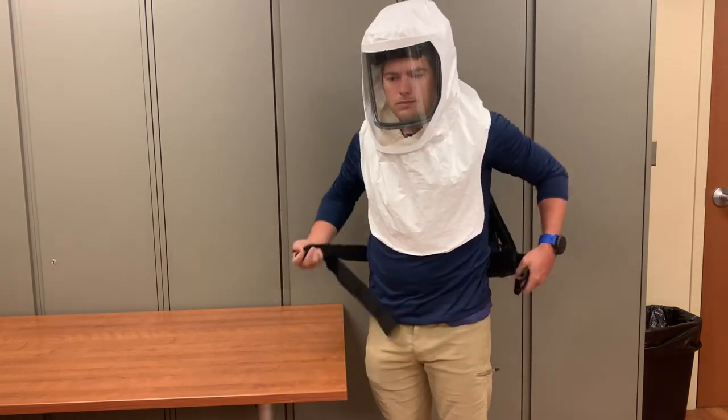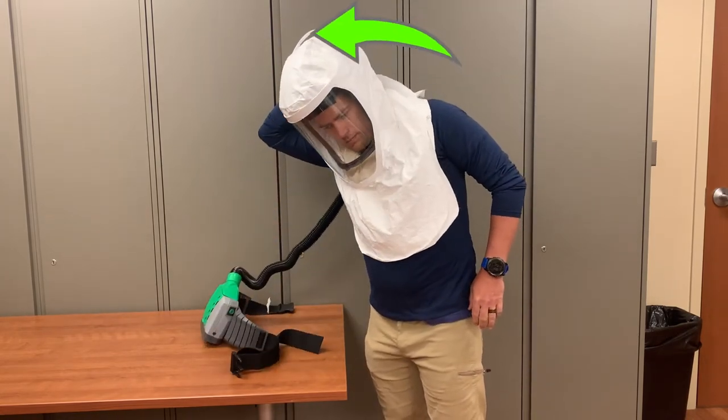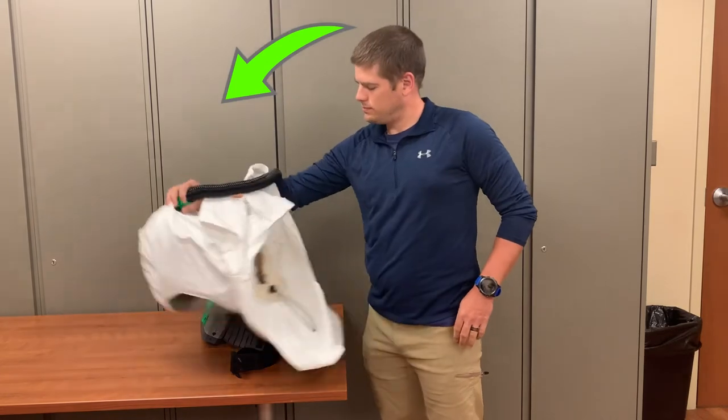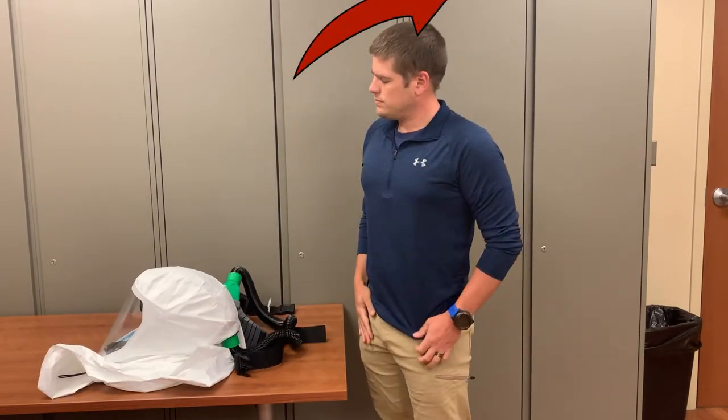To remove the PAPR, unclip the belt and then, by taking hold of the hose on the back of the hood, pull the hood off and away from your face — not up and over. This will minimize the risk of passing the contaminated PAPR hood over your face.